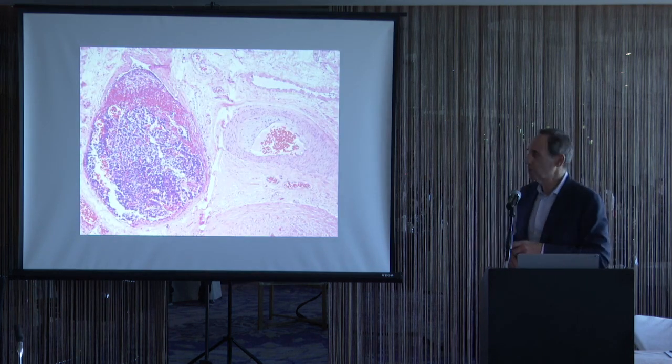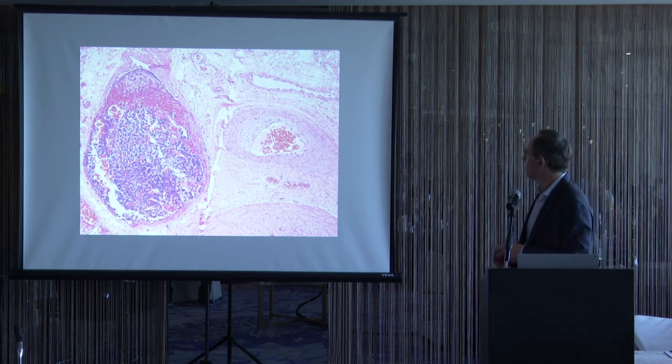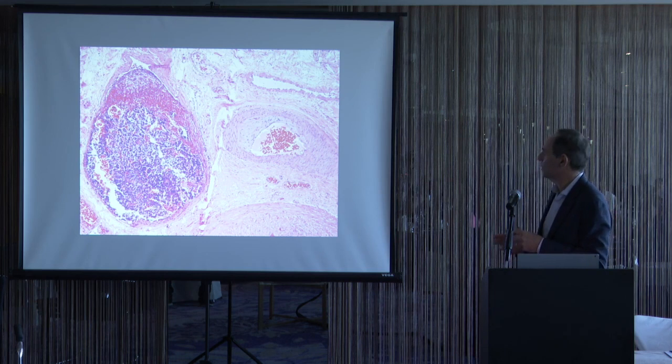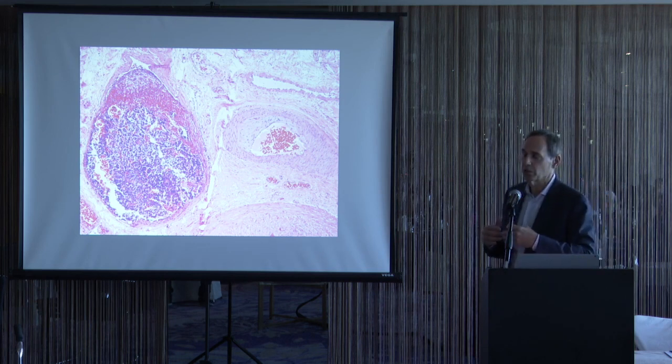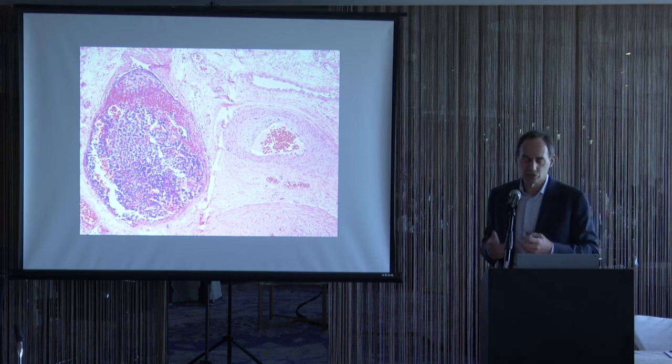This is embryonal carcinoma. Embryonal carcinoma is, I think, a little easier to tell versus seminoma, artifactual. But also, even with embryonal carcinoma, you want to make sure that it follows the same criteria, either being attached to the lumen, has a thrombus associated with it, reendothelialization. But here you can see the vessel on the outside. There's a blood clot that's undergoing organization with this embryonal carcinoma associated with it. So that tells us it's been there for a while and that it's a true vascular invasion.